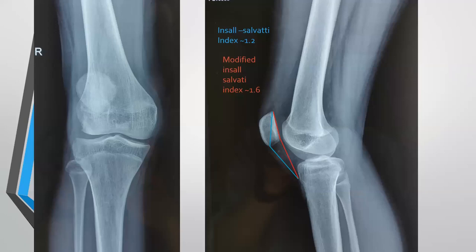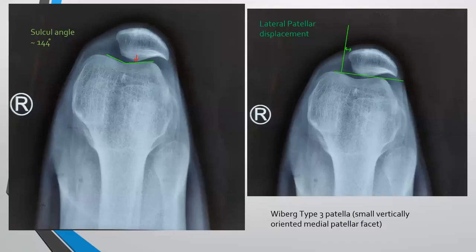This is a plain radiograph AP and lateral view showing the Insall-Salvati index as 1.2 and modified Insall-Salvati index at 1.6. The Skyline-Merchant view depicts the sulcal angle as 144 degrees, and there is lateral patellar displacement. We can see there is a small, vertically oriented medial patellar facet. So, it is a type 3 patella.